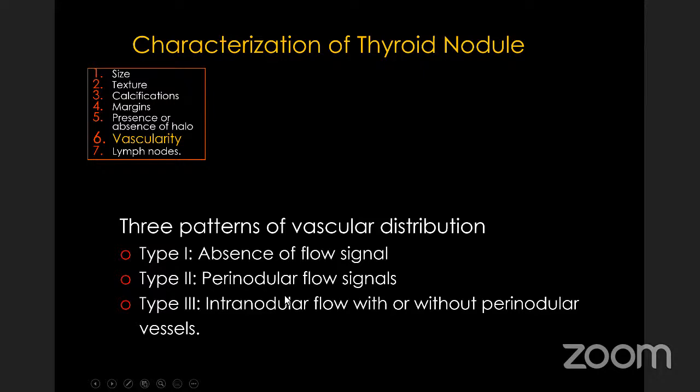But as with the other characteristics, if vascularization is used as the only predictor of malignancy, it will not give you a very good indication of either malignancy or benign. It will not be accurate. It should be used in combination with other features.